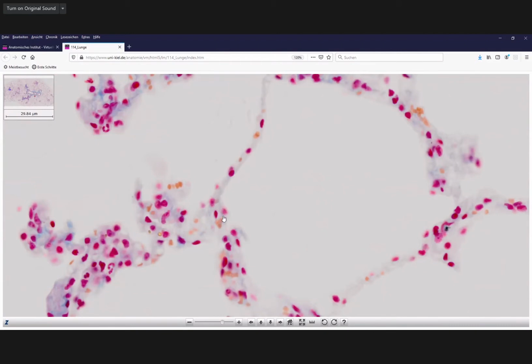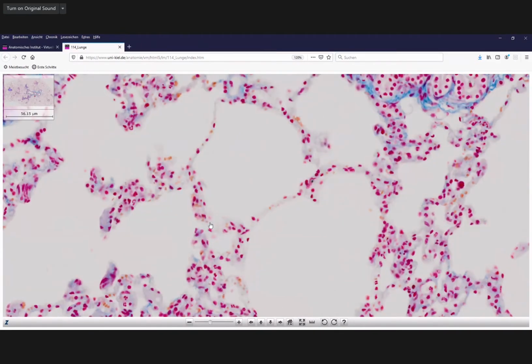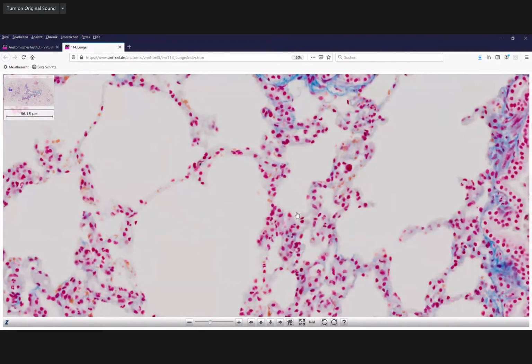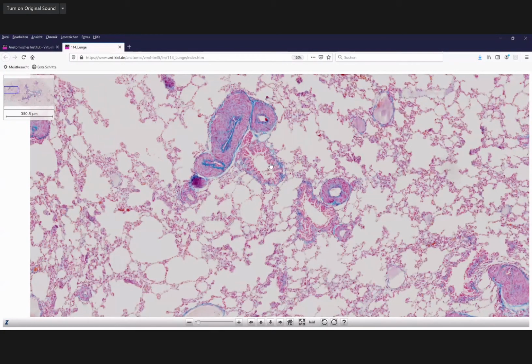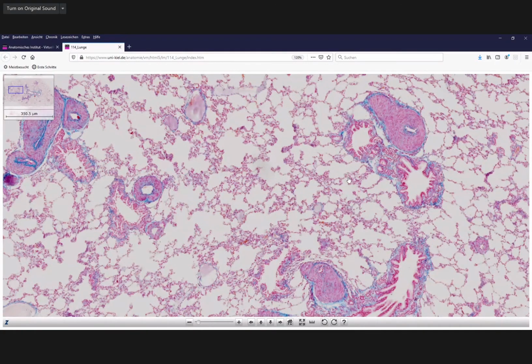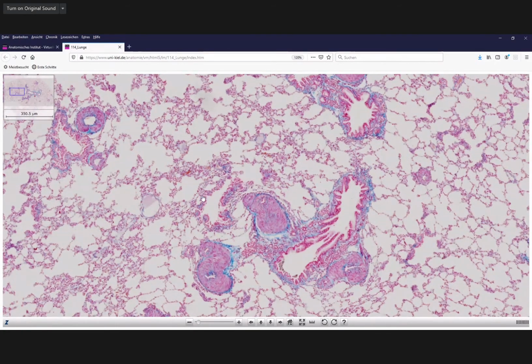And the next specimen shows this much nicer. That's why we should not spend too much time on these interalveolar septa, because the other specimen is much better. It has a better resolution, a better fixation, and so on. But this specimen is very good to look at late bronchioles, early bronchioles, where you even have a few glands, and the bronchi.